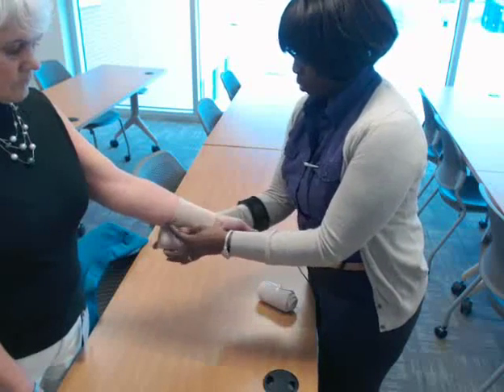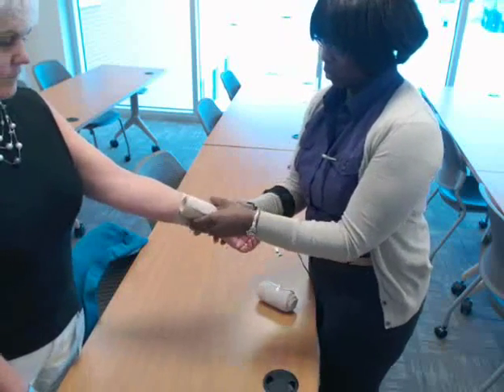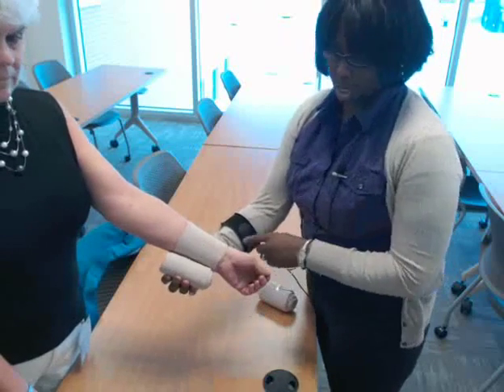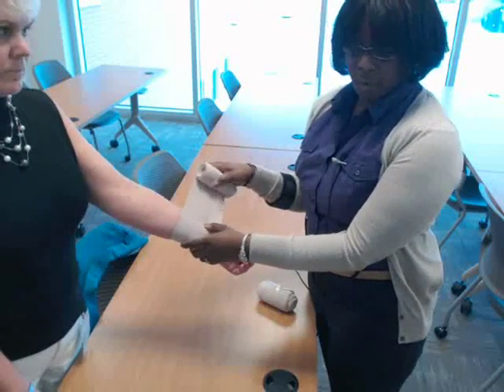The first demonstration I'm going to show you is just the basic circular wrap. You just keep going around in the same area. All bandages start with the circular wrap first.